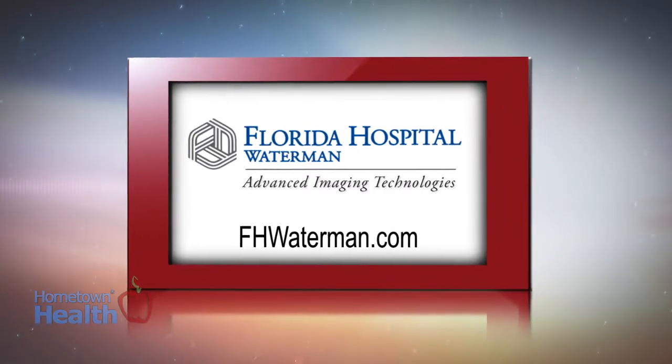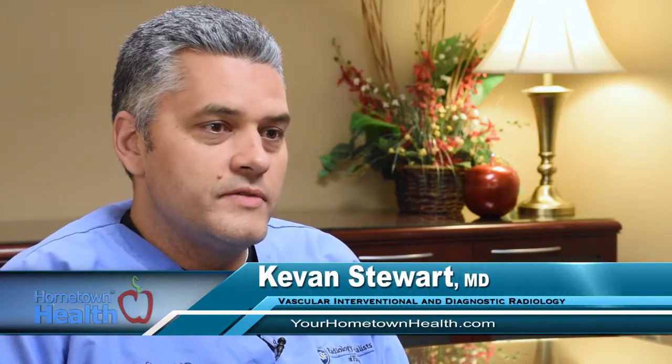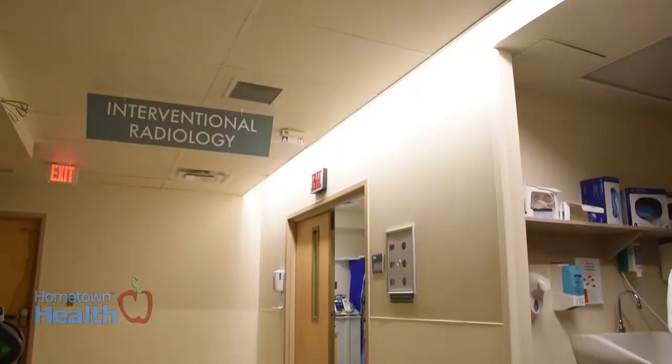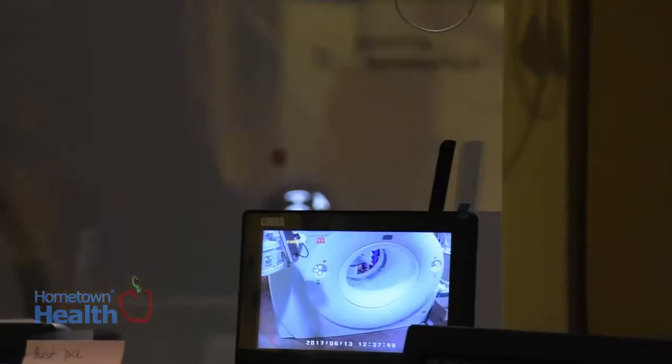With interventional radiology, we use imaging to do minimally invasive procedures for people. So we use either ultrasound or live x-ray, which we call fluoroscopy, or CT, primarily to do procedures for people. We do stuff head to toe in the body all the time, all the way down to the lower extremities, and open up blood vessels, shut off blood vessels, do biopsies, drainages, chest tubes.